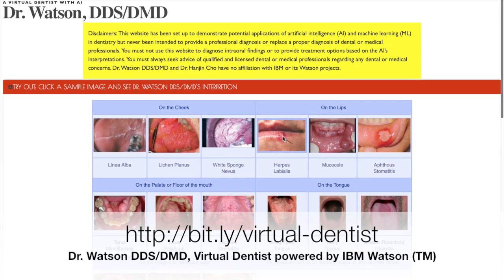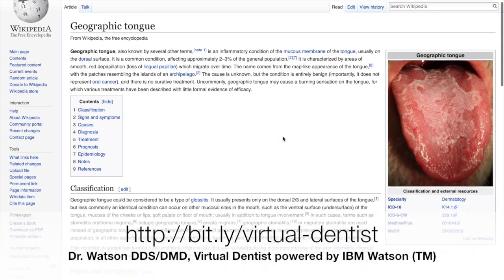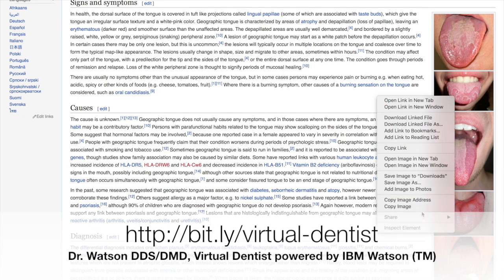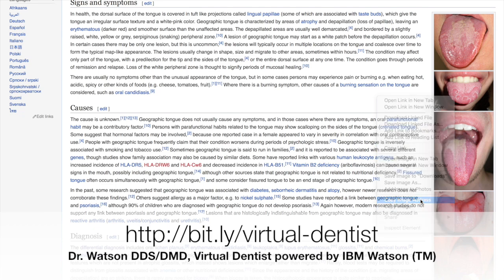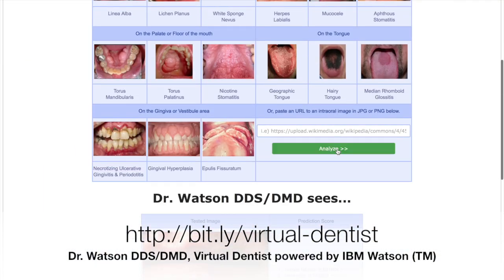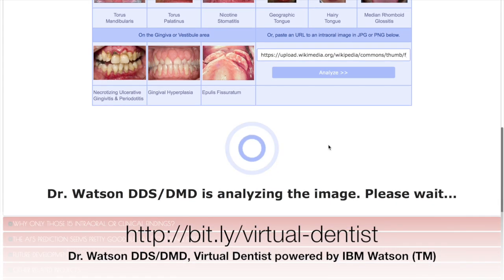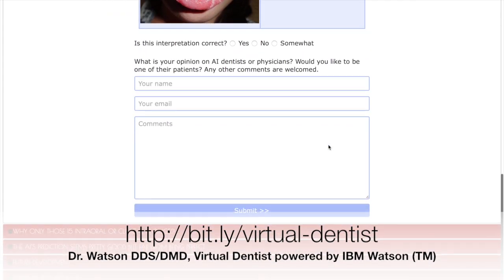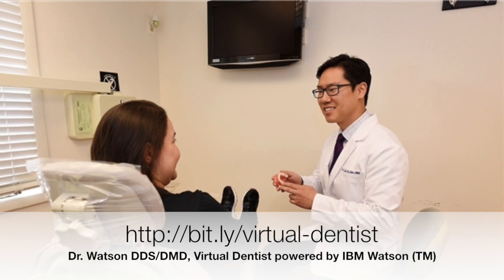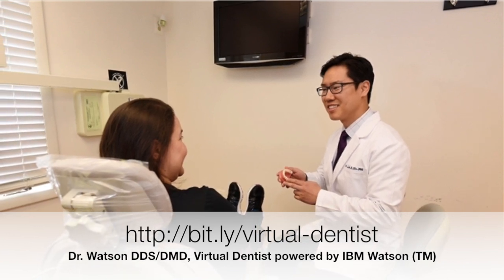My ultimate goal is to produce an AI that can analyze patients' x-rays and intraoral camera images, understand patients' medical and dental history written in a narrative form, and finally produce patients' full treatment plan automatically. So by the time you sit next to the patient, a complete treatment plan is ready for you to review.